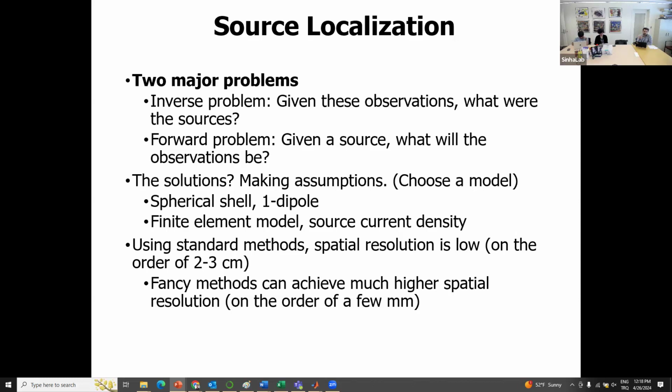So in the inverse problem, what you see is basically x, which is the EEG signal that you collect from your experiments. And the question is, what is A, the mixing matrix? Because if you calculate the mixing matrix, then you can multiply the inverse of that matrix by the EEG signals, which is x, to estimate the source signals, right? So the challenge here is that you don't know what A is, the mixing matrix, as well as the source signal. So you don't know A and s.